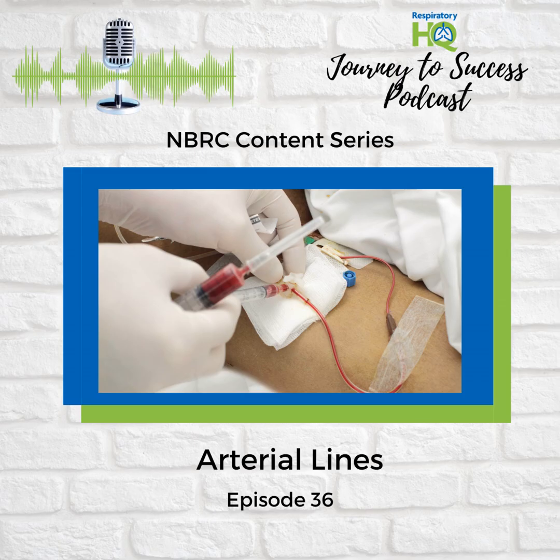You got it. And that's just one way aging affects the arterial pressure waveform, which is what doctors see on the monitor. So it's like each heartbeat creates a little signature. Yeah. And that signature changes over our lifetime. I like that. And it's not just age. What else? The source mentions things like arrhythmias. Arrhythmias, those are irregular heartbeats, right? I bet those mess things up. Totally. An arrhythmia makes the waveform look crazy, with irregular peaks and valleys. Then there's hypertension, which is high blood pressure. So that would make the whole waveform higher. Exactly.